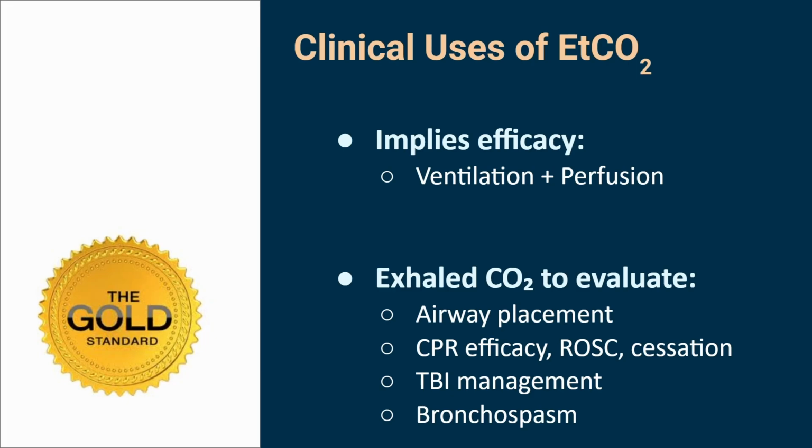I think it was simply because my paramedic teacher said, if you don't see that tube pass through the vocal cords, then you didn't intubate. Simple as that. So anytime I couldn't see the vocal cords, I would think, well, it's not good, and I would pull it. End tidal needs to be our standard for that. Now, we don't intubate, but we should be putting it on iGels or Kings or combi tubes. If you put it on an LMA or a King LT, and your end tidal is 0, something is very, very wrong. It probably means that you're not in the right place.